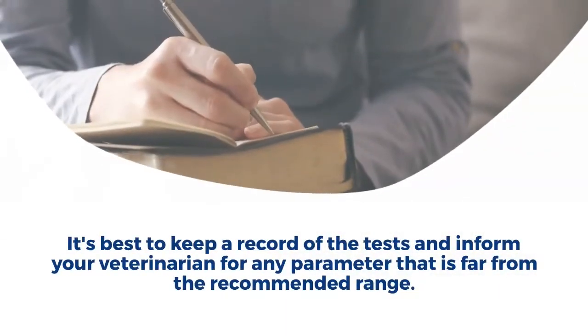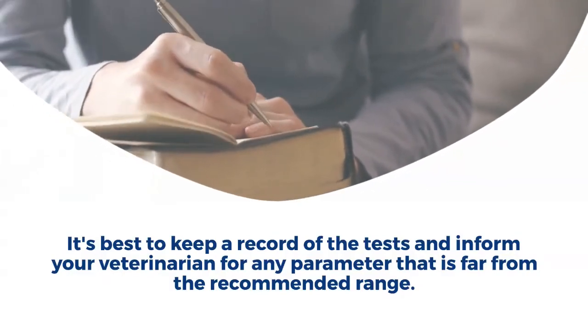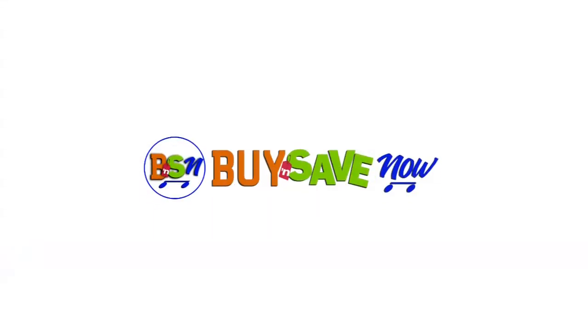Step 4: Note that it's best to keep a record of the tests and inform your veterinarian for any parameter that is far from the recommended range. For quality and affordability, buy and save now.